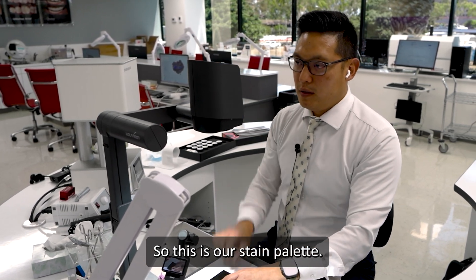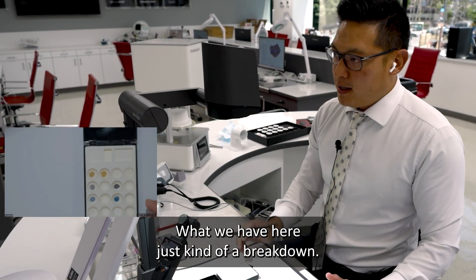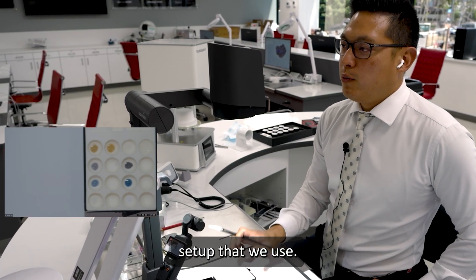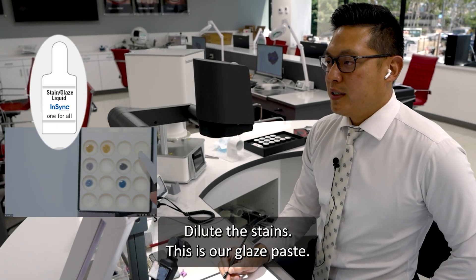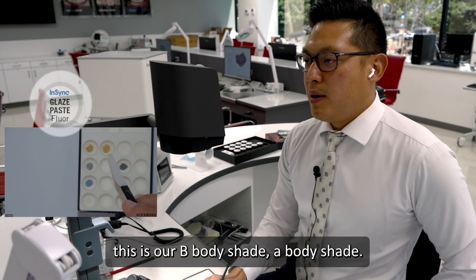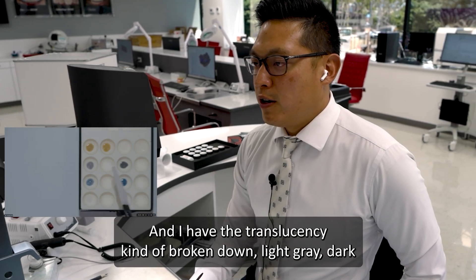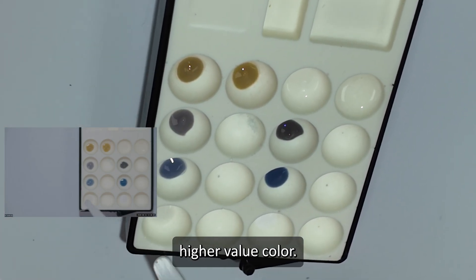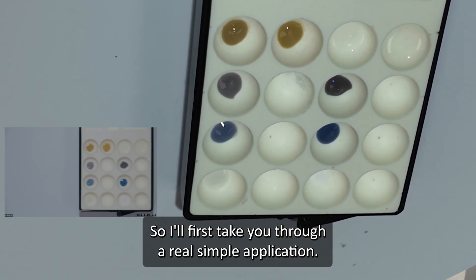This is our stain palette. The colors are arranged — just a breakdown of what we have here, and if you come for the anterior course, this is the exact same setup. The glaze liquid is what we use to moisten the brush, clean the brush off, and dilute the stains. This is our glaze paste — that's what makes things shiny and seals everything in. This is our B body shade, A body shade. And I have the translucencies broken down: light gray, dark gray, light blue, dark blue. This is the lumen — a brightening, higher value color. And this is Snow, the non-translucent white.